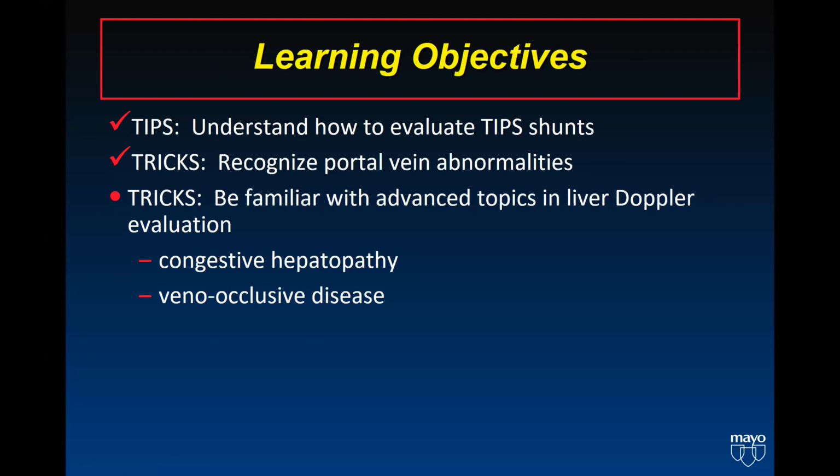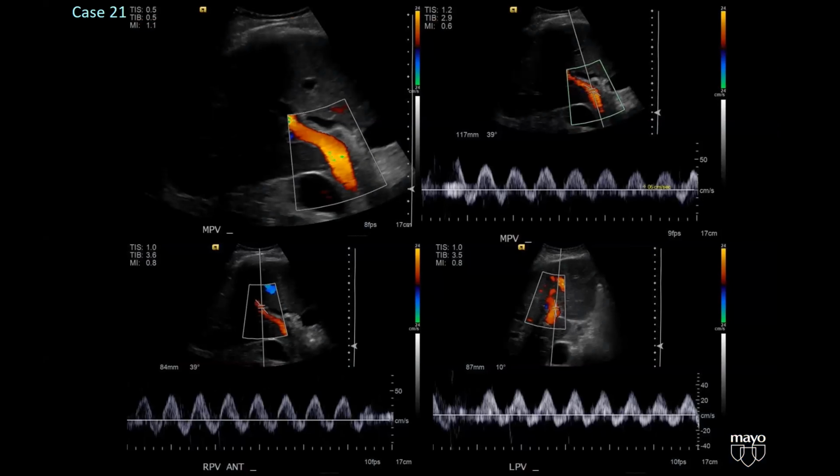So our objectives today were to look at tips and to recognize some tricks. There's two clinical scenarios I want to leave you with that can be confusing, that I want to make sure you never get wrong. And so first, congestive hepatopathy.